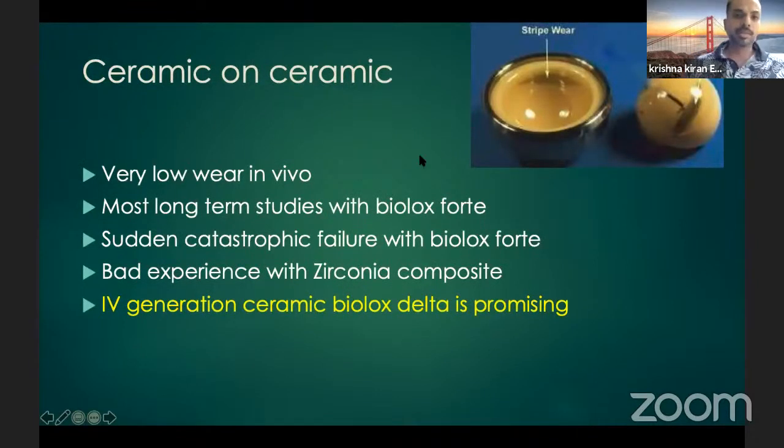Now, ceramic on ceramic is a slightly controversial topic. It has been shown to have very low wear rate in vivo. However, most long-term studies are with Biolox Forte, and there is a potential for sudden catastrophic failure with head fractures, which has been reported with Biolox Forte. And there has been bad experience with the zirconia composite, which was used between 1996 and 2005.